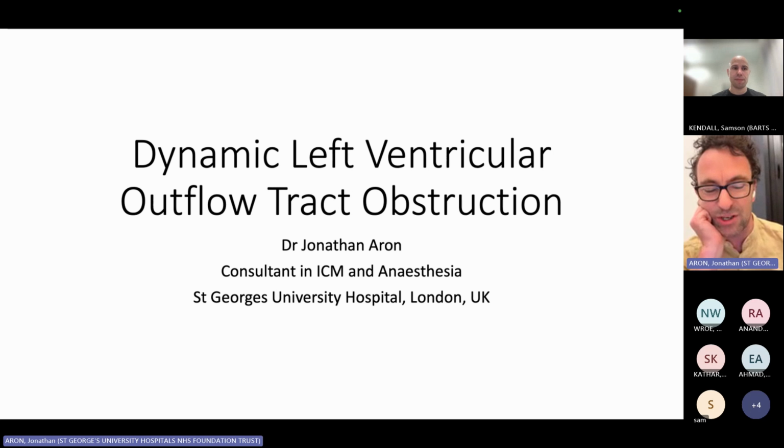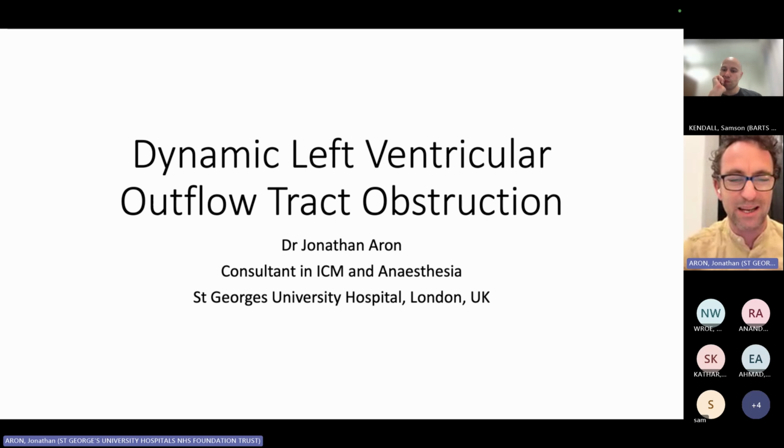The people that know me will say that this is my favorite diagnosis on echo. So it's quite a nice thing for me to talk about. I'd like to say that this condition is completely invisible unless you echo. You don't know that you have it unless you get a set of physiological conditions that would induce it in most patients. As I'll hopefully get you to realize, without echo, it is basically undiagnosable.